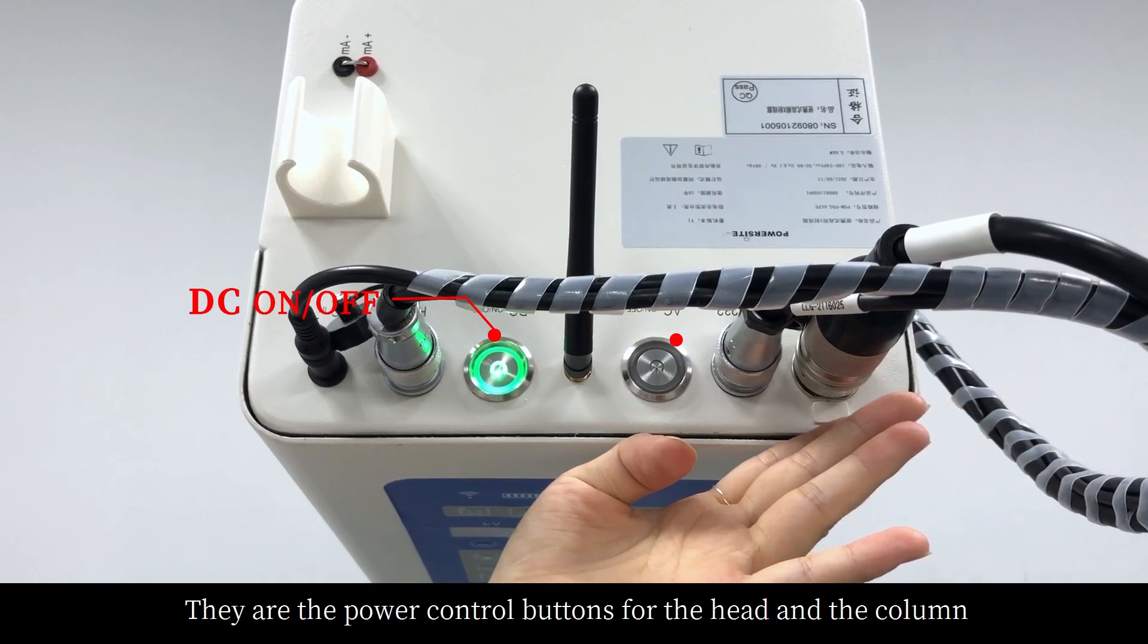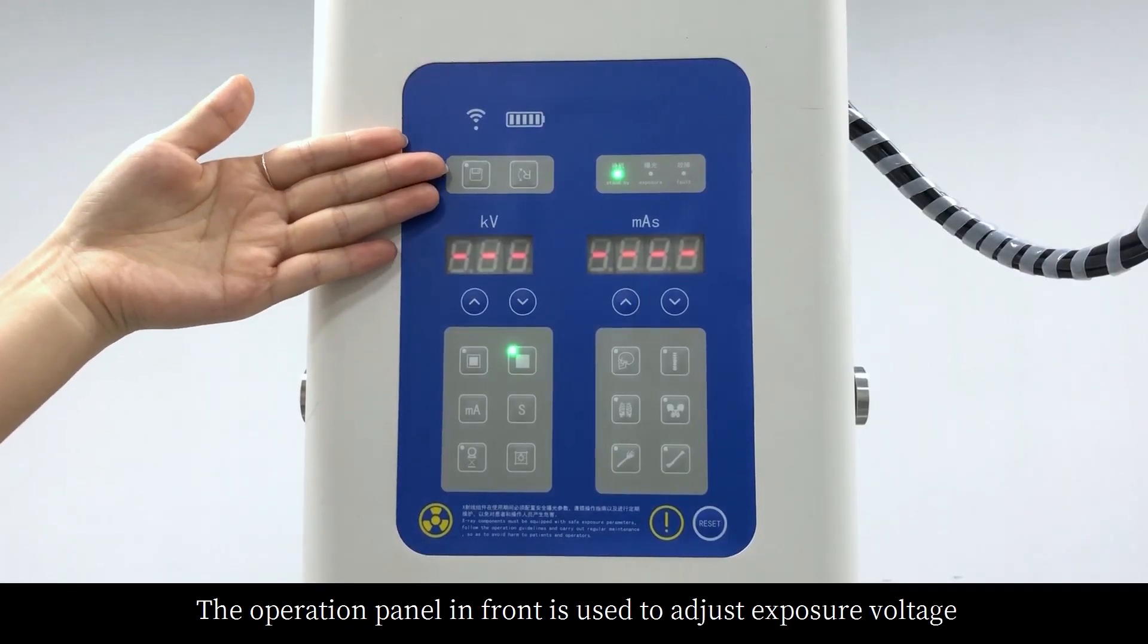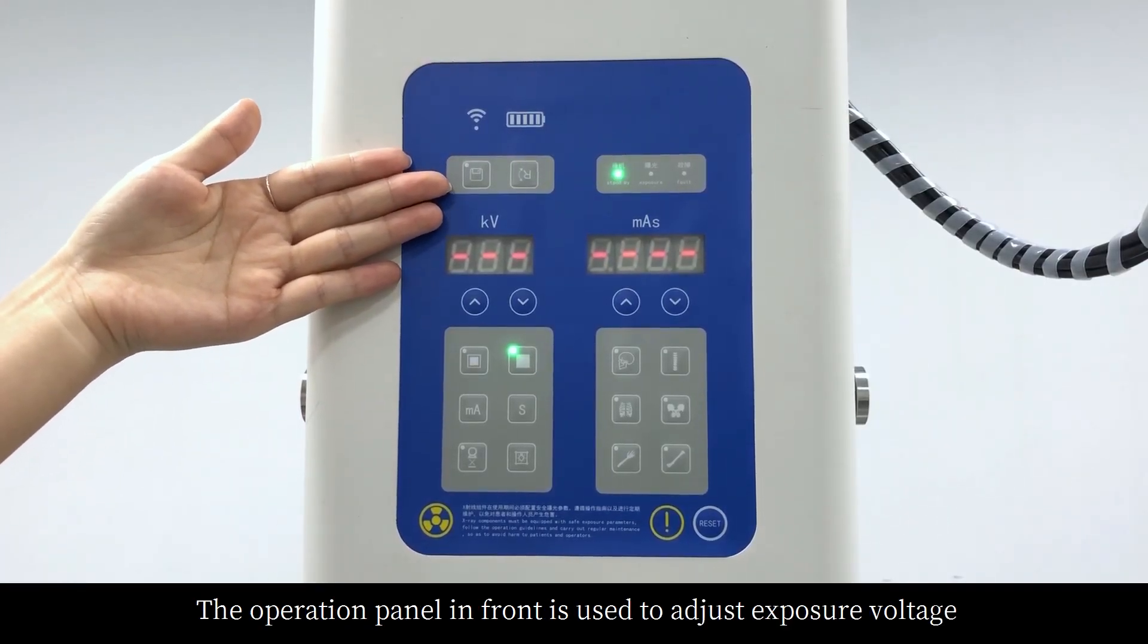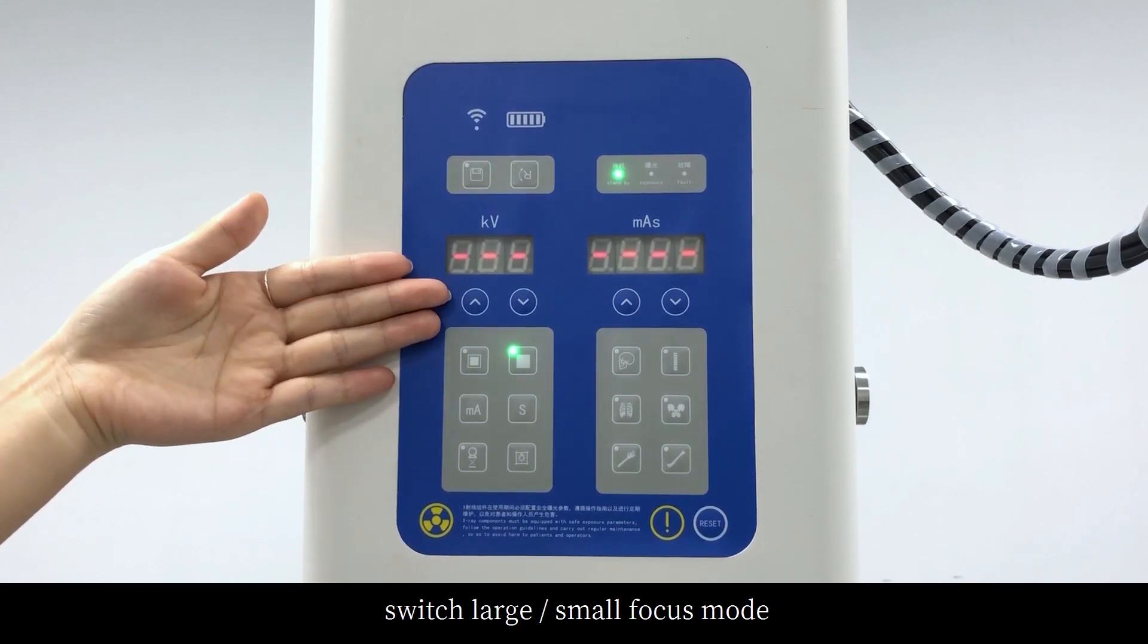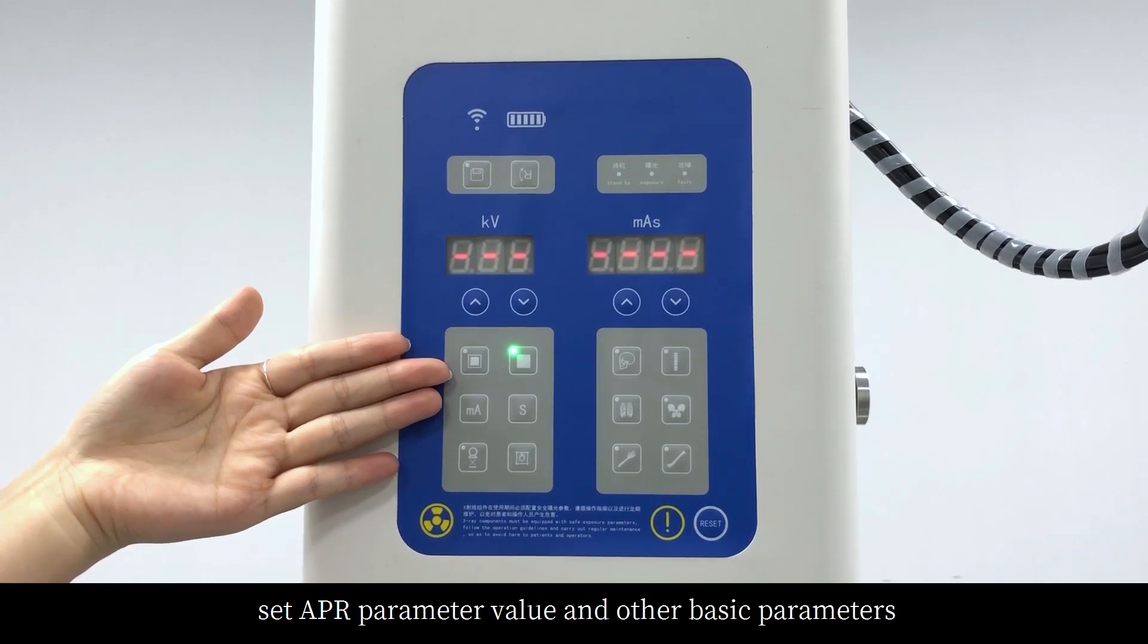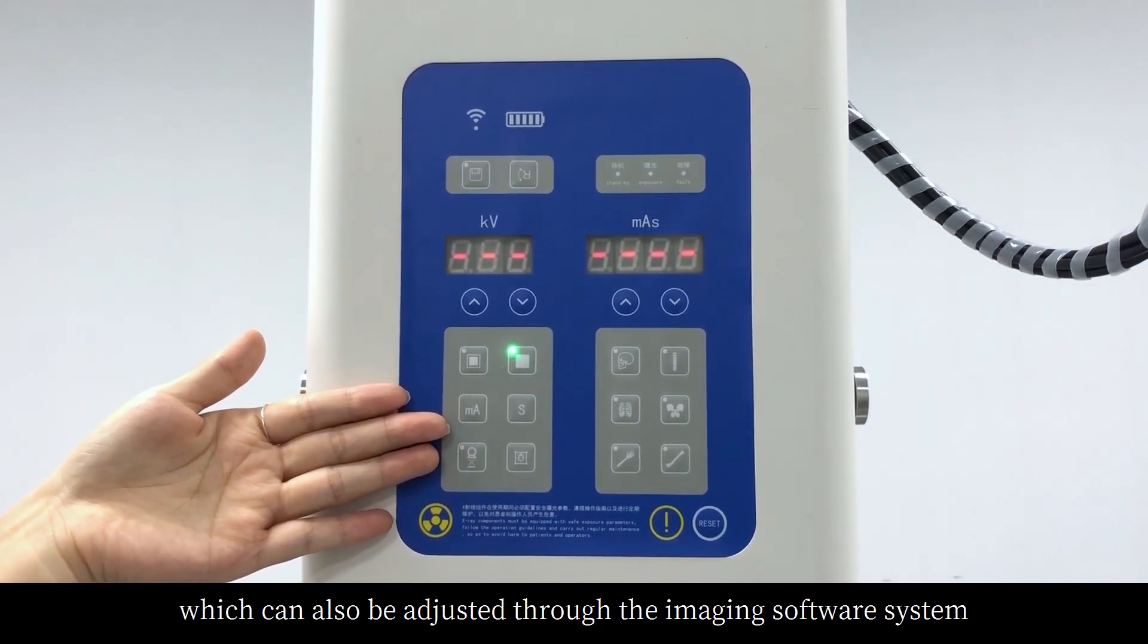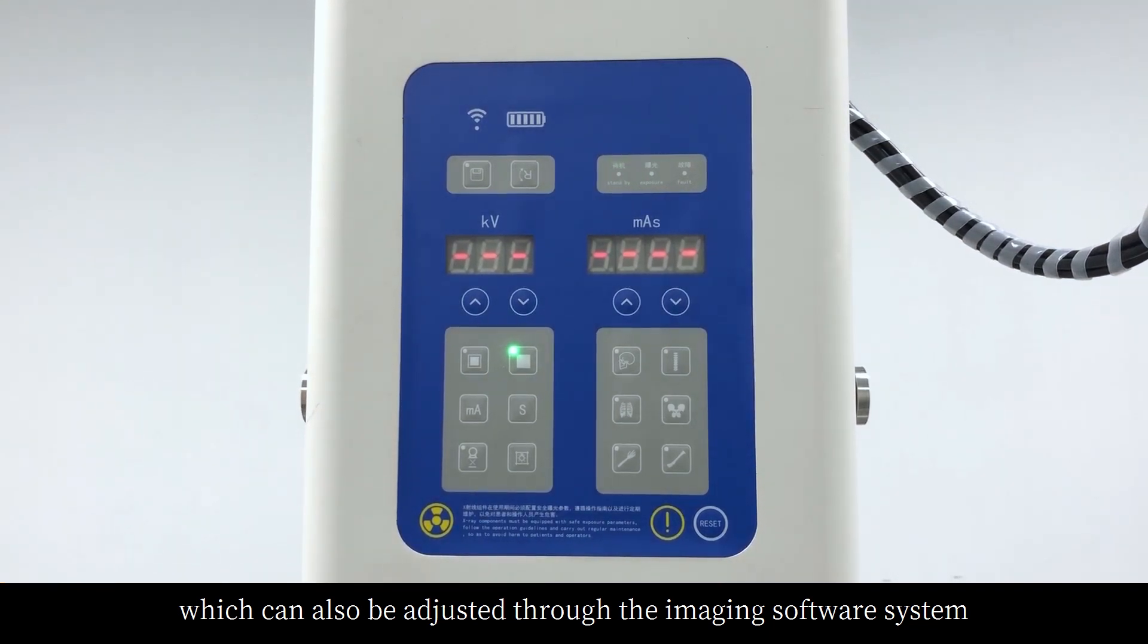They are the power control buttons for the head and the column. The operation panel in front is used to adjust exposure voltage, switch between large and small focus mode, set APR parameter value and other basic parameters, which can also be adjusted through the imaging software system.